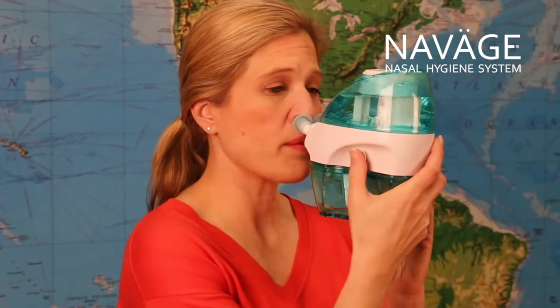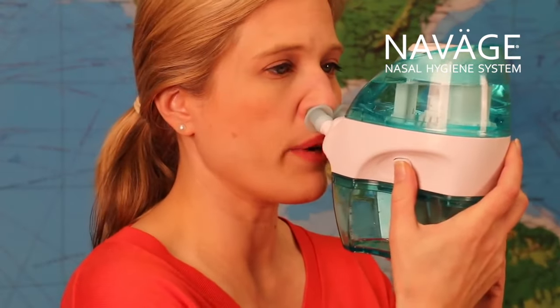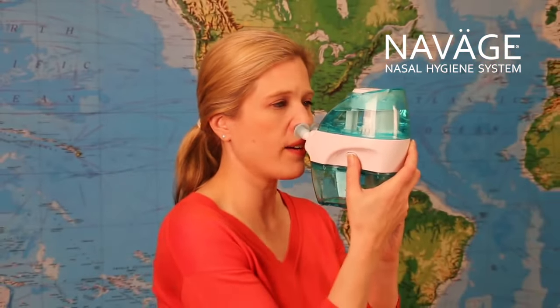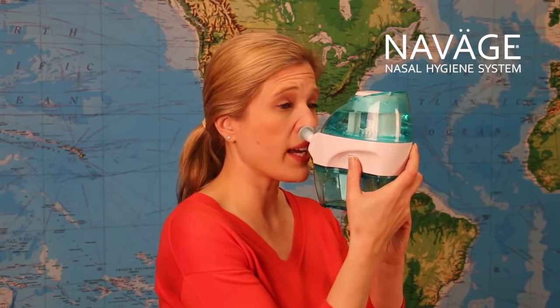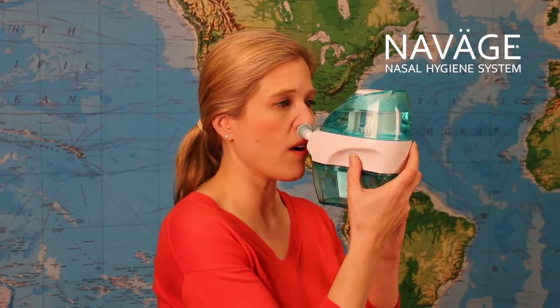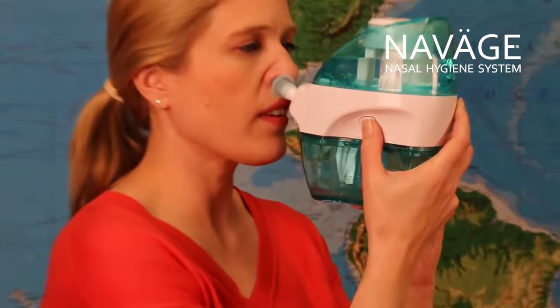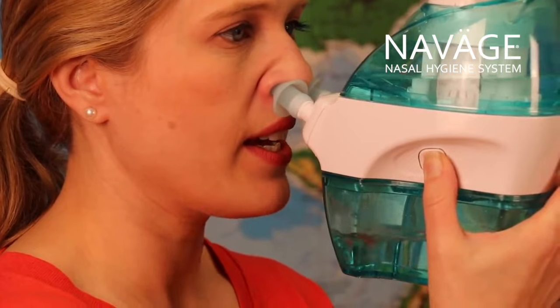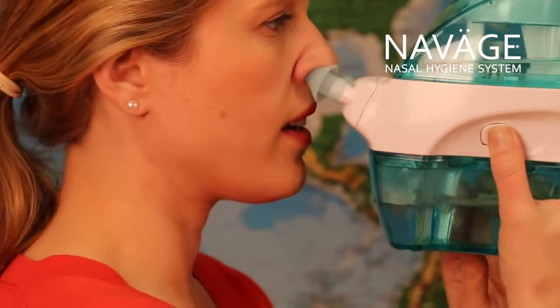Next I put the nose pillows in my nose, placing them so that there's no gap but that it's still comfortable. Now I'm going to press the start button but only halfway — I can feel the gentle suction right now. Now I'm ready and I'm going to press the button all the way in. The saline you can actually see going from the upper tank down to the bottom tank. There we go. It's really easy and it feels great.